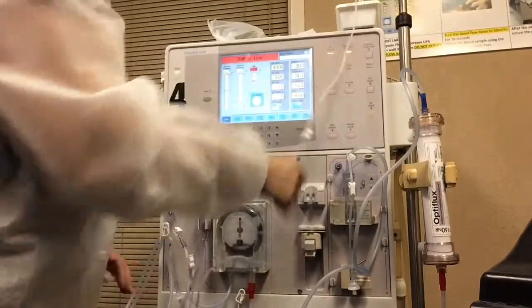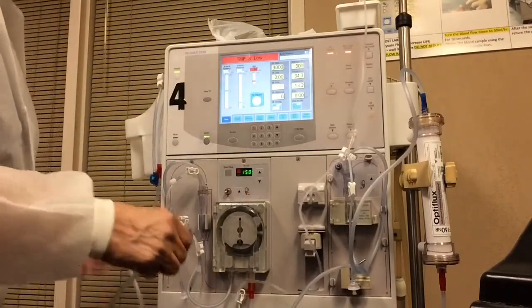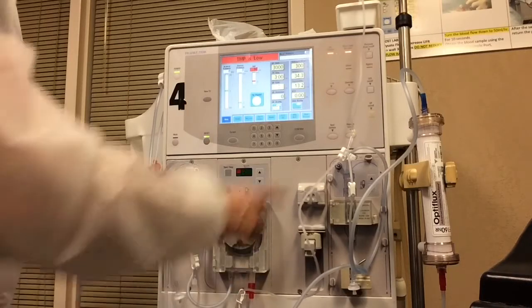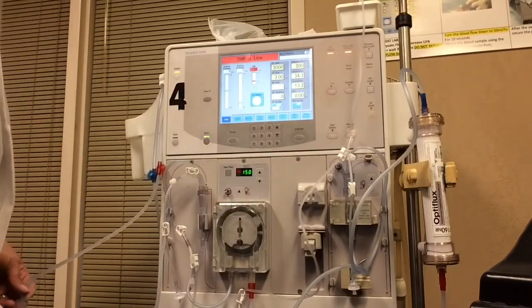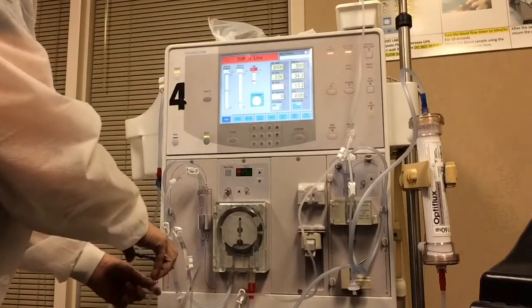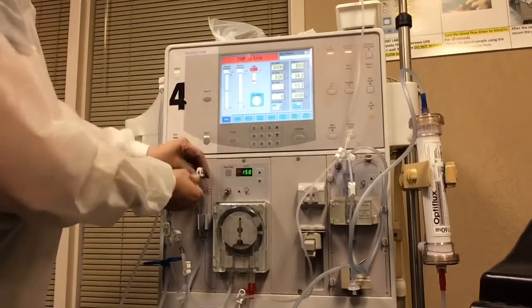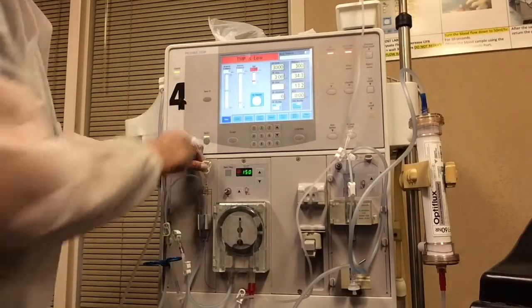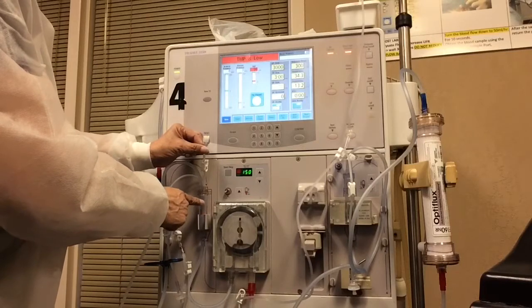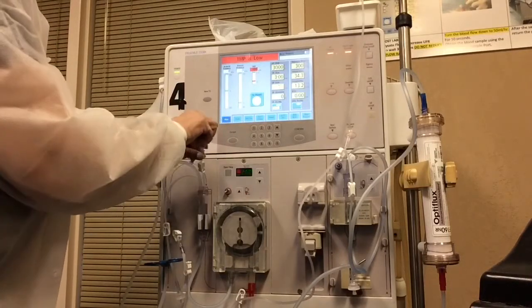Right now I'm going to spike the normal saline using aseptic technique — always aseptic technique. Now I'm going to open the saline line and prime to gravity. You can see bubbles coming through; the bottom portion is priming. The saline is coming through the bottom portion by gravity. I'm going to clamp below the saline T. Now I'm going to fill the arterial chamber — take the saline, take the clamp off, and open this cap very, very slowly. You can see that saline is going to fill this chamber. Then you're going to close and clamp.